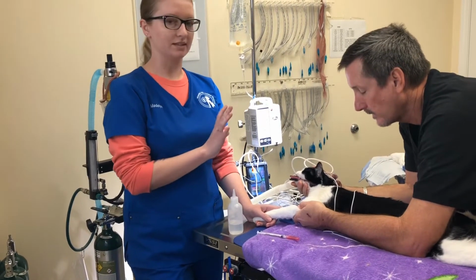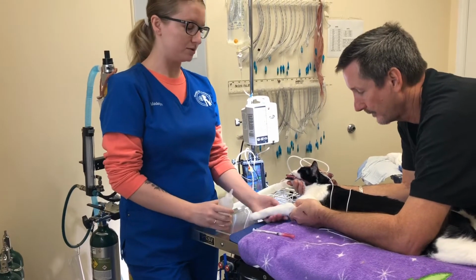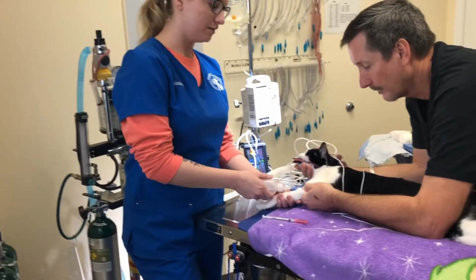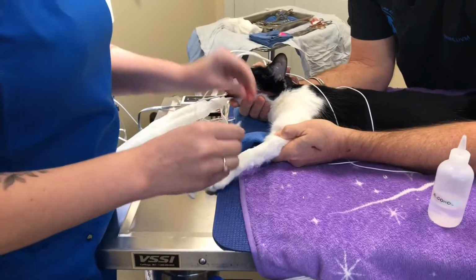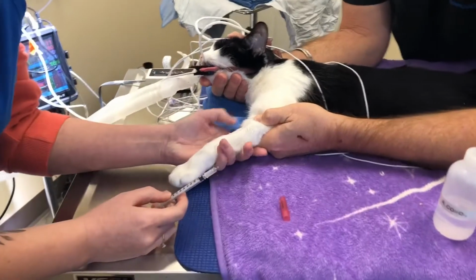Okay, now I will be demonstrating a blood draw from a cephalic vein on a feline patient. This patient is obviously anesthetized. To do this, I'll have my alcohol, which I will use to sterilize my site, but also help me visualize the vein. And I have my restrainer occluding the vein for me. And then I will use a 1 cc syringe with a 25 gauge needle, a super small needle, because cat veins are smaller.